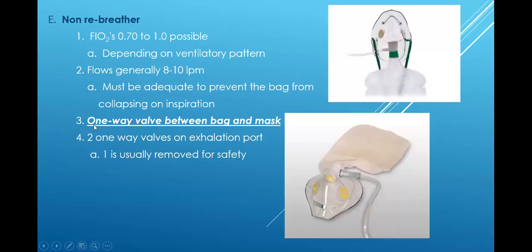Okay, now we need to get into what's called high flow devices. Okay, high flow devices. So let's look at it. The non-rebreather has a one-way valve between the bag and the mask, and two one-way valves on the exhalation port, but one is usually removed for safety.